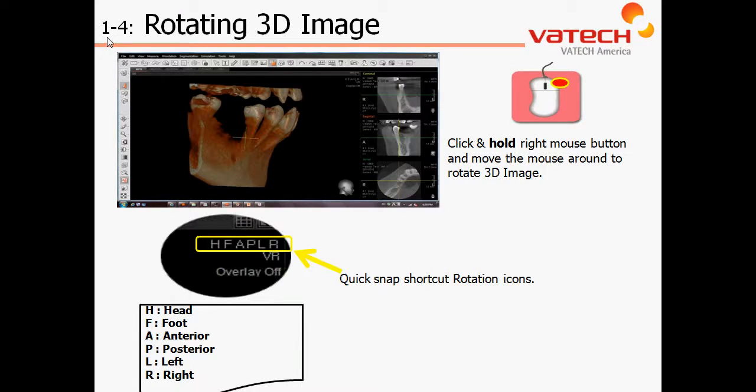Moving on to chapter 1, section 4: rotating our 3D image. We have a number of different options to perform this.